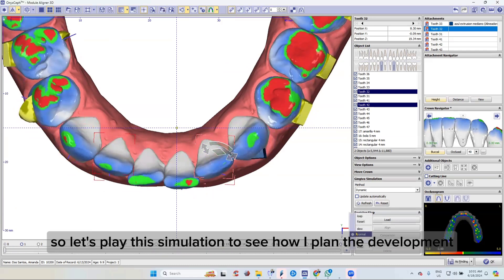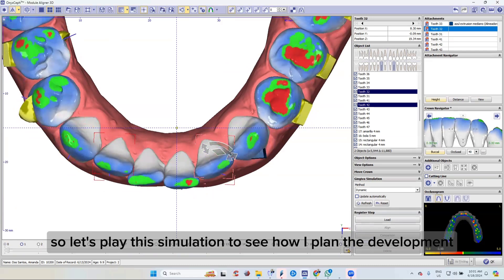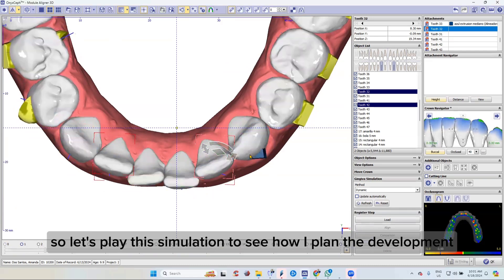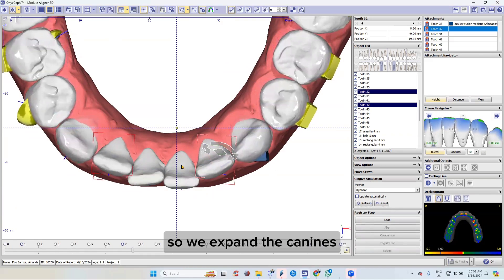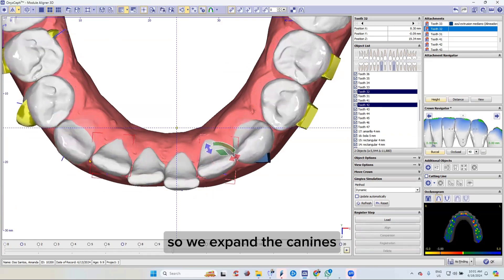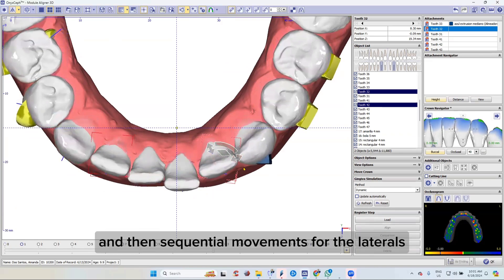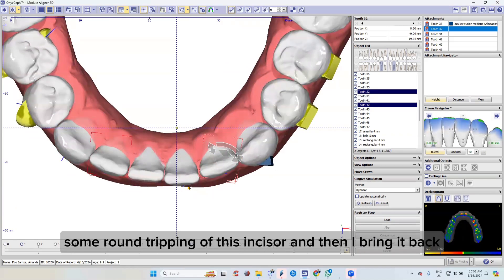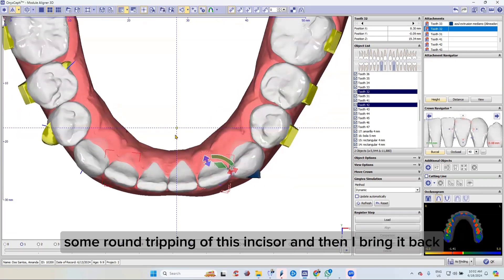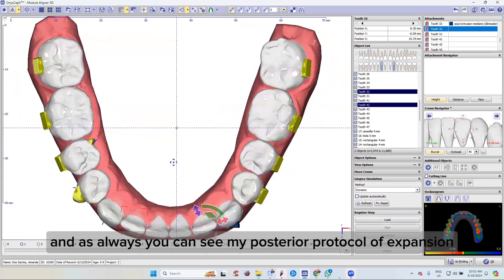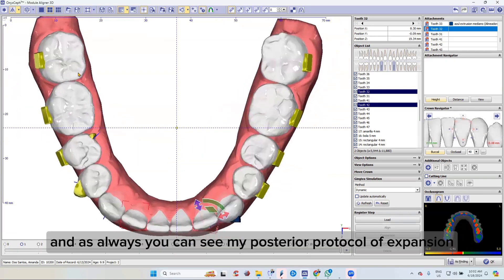Let's play this simulation to see how I plan the movements. We expand the canines and then sequential movements for the laterals. I'm round tripping this incisor and then I bring it back.